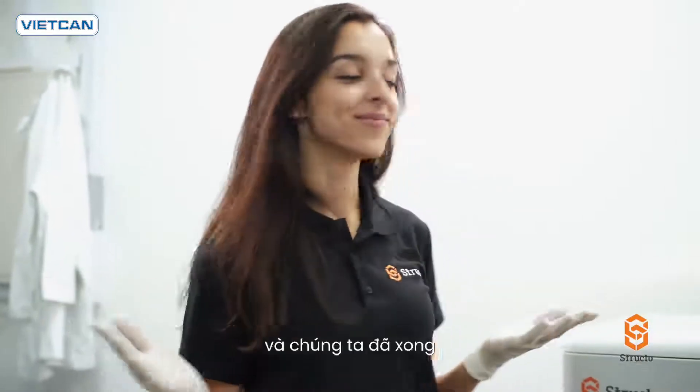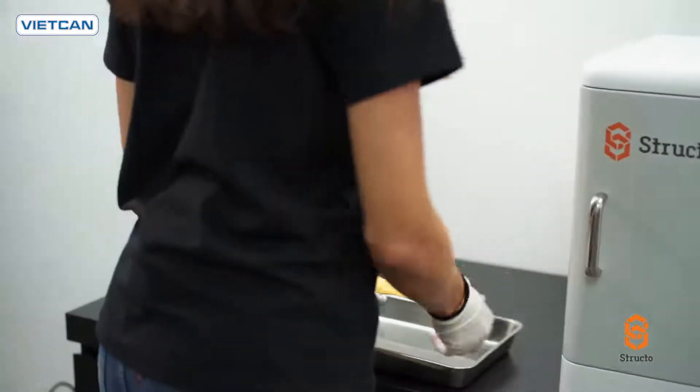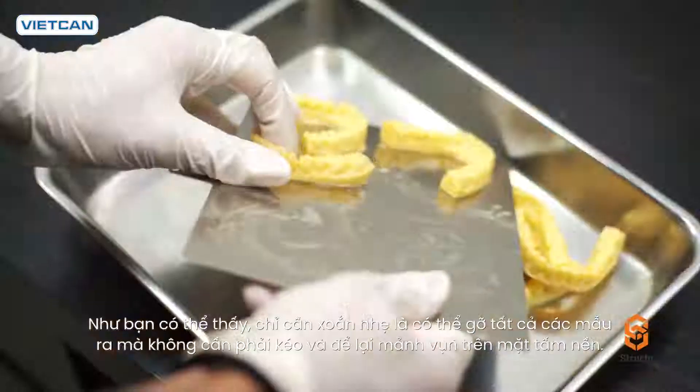And we're done! As you can see, with just a slight twist, all the models can be released from the platform. No more tugging or scraping with a blade.